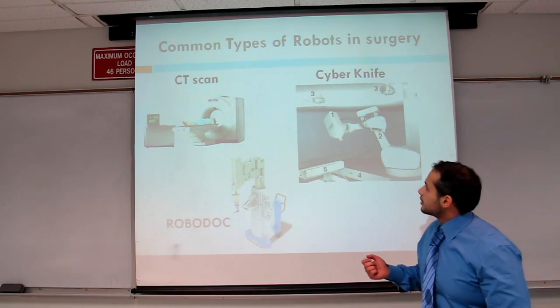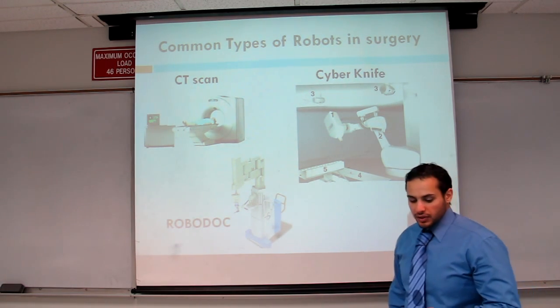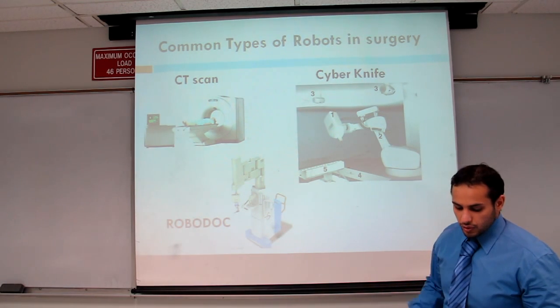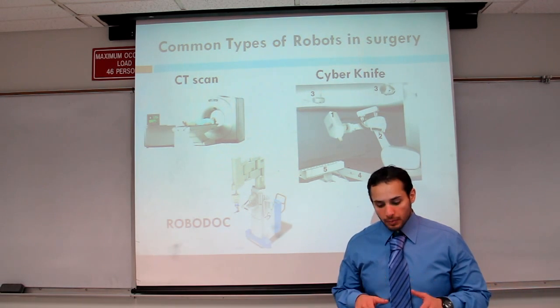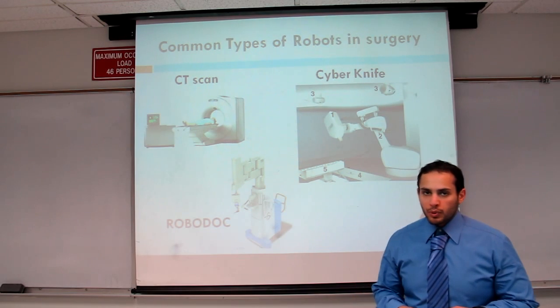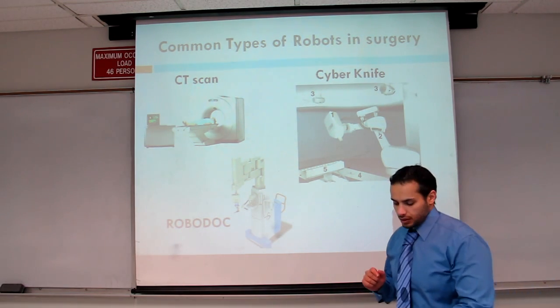The second type is the CyberKnife. The CyberKnife system is a non-invasive radiosurgical device for tumor destroying. It is a unique device that integrates robotics with image guidance technology. It is approved by the Food and Drug Administration, the FDA.